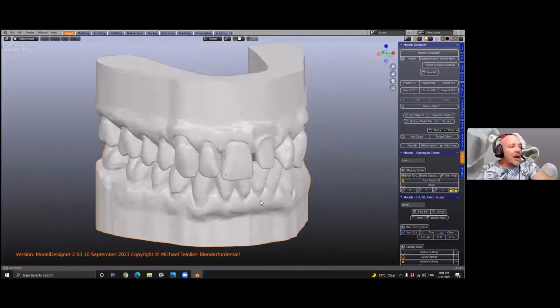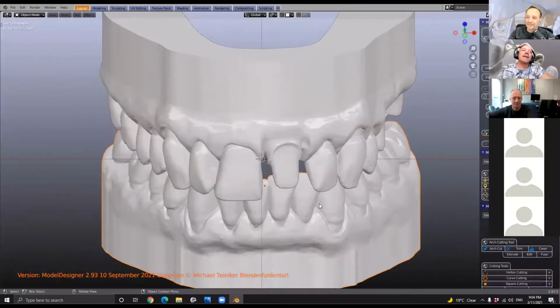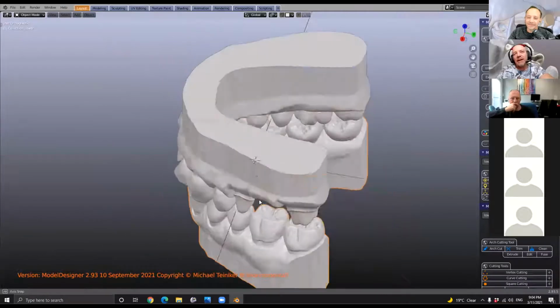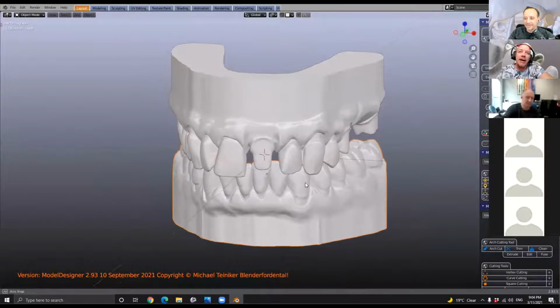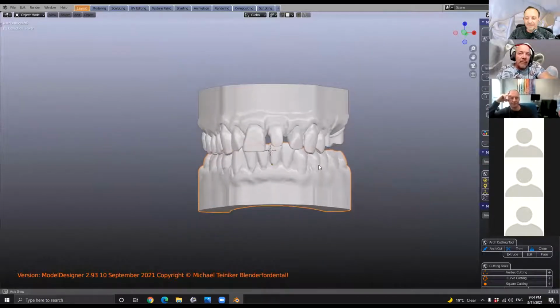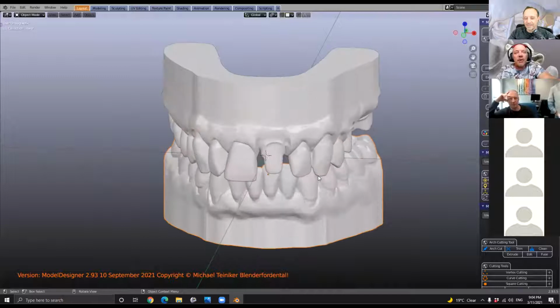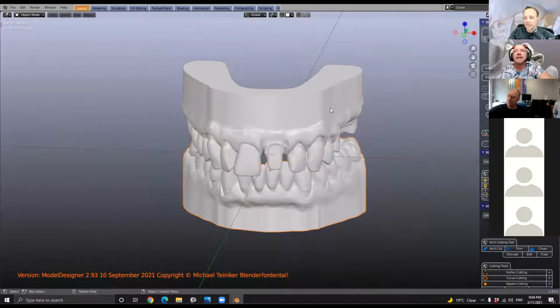All right, these are Ivan's nice models. We take them into the center of Blender as we usually do, and for good reason. And this is even more of a reason because these vertex inserts are in the center of Blender. So we won't get away taking shortcuts there. Also, we've made model bases. You can't work with an open scan. You need a base, a model base.